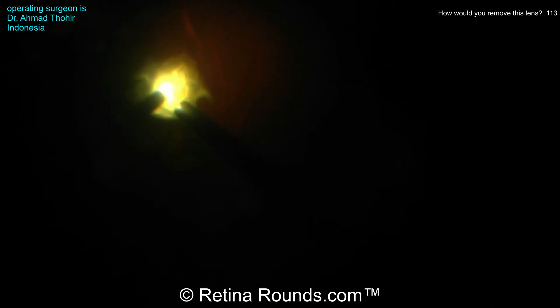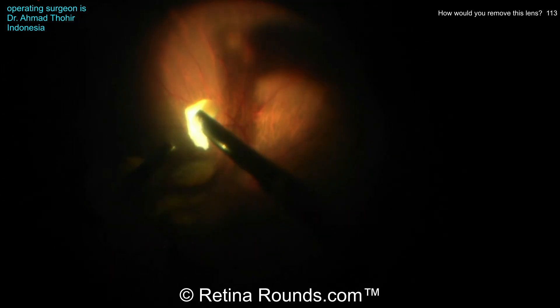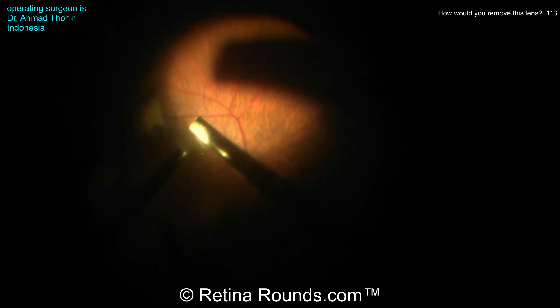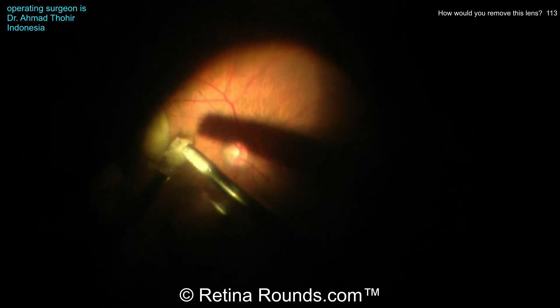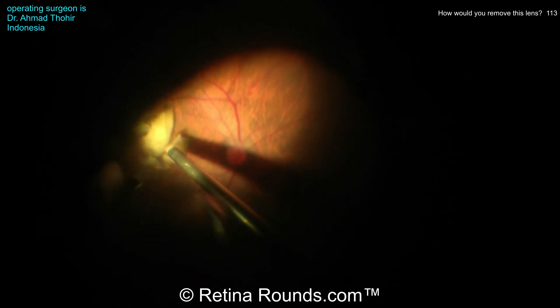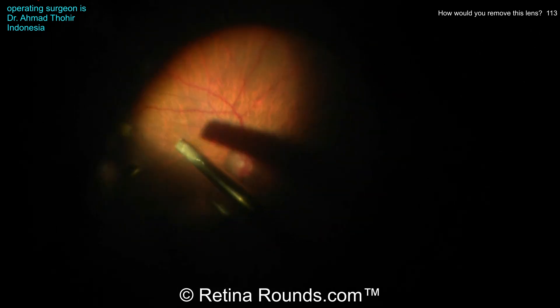Remember that you can modulate some of the parameters on the machine to allow for more followability and better efficiency of lens removal. If the emulsification power is not strong enough to cut through the lens, you can increase the power. If the lens is not folding into the cutter, you can increase the vacuum. And if the lens is being repelled or jackhammered away from the probe, you can use a pulse setting, which will decrease the duty cycle of emulsification. Pulses of ultrasound will be administered with brief periods where the probe is just aspirating, helping to hold the lens in proper position.